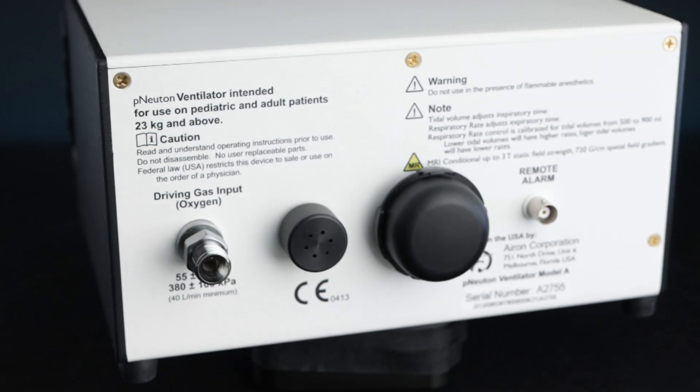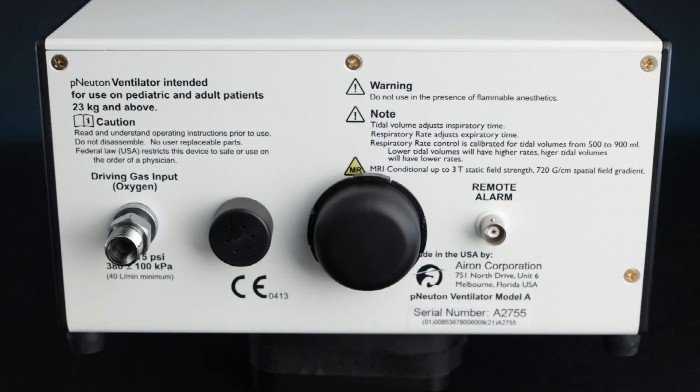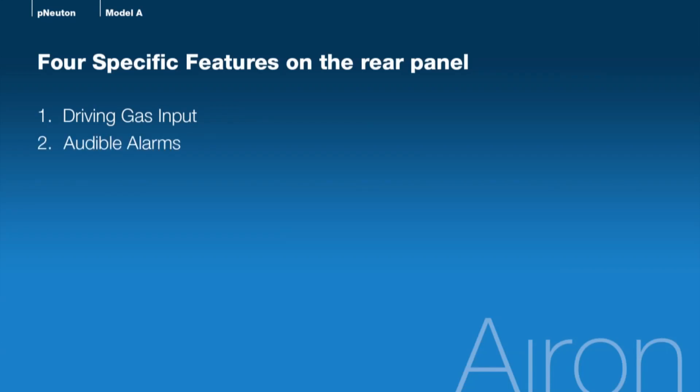Let's start our product in-service. We'll begin at the unit's rear panel and look at four specific features: driving gas input, audible alarms, air intake and filter, and remote alarm output.